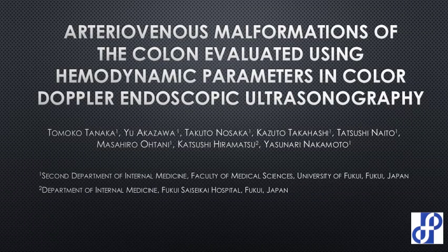Arteriovenous malformation of the colon evaluated using hemodynamic parameters in color Doppler endoscopic ultrasonography.